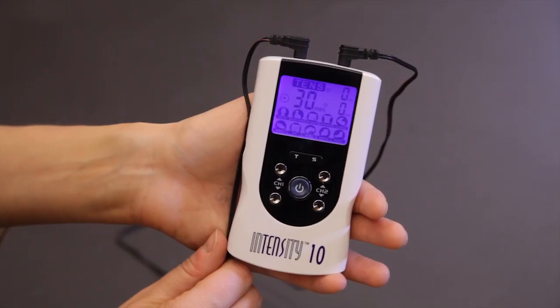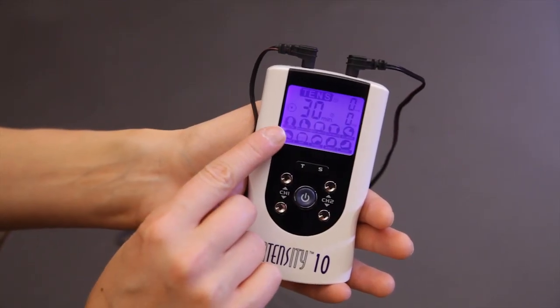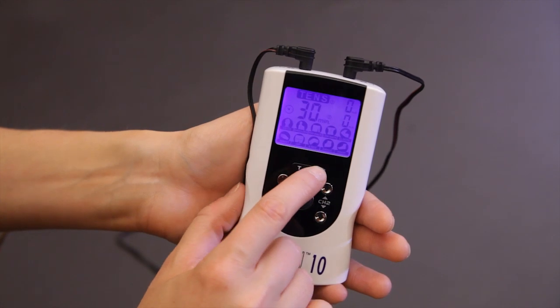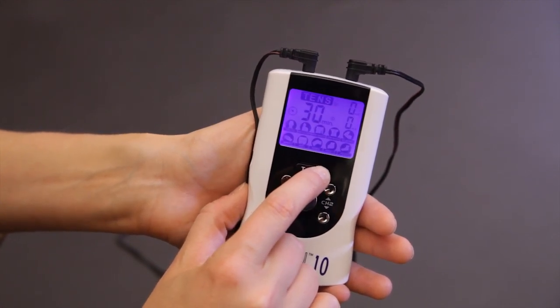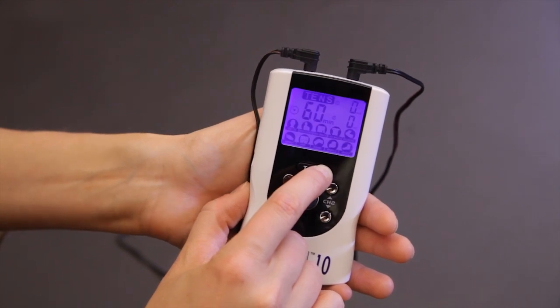To select the appropriate mode for the area being treated, press the S button to scroll through each mode. Each mode will flash on and off, identifying the current mode selected.